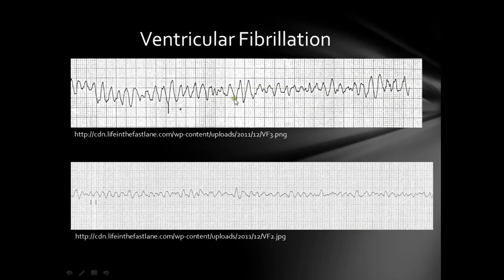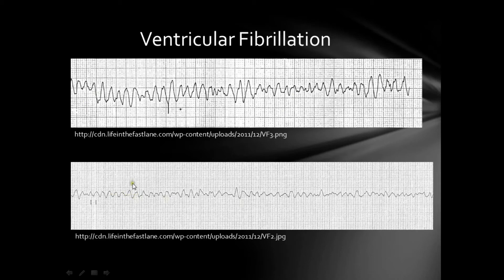On the first ECG here, we can see a typical coarse ventricular fibrillation: chaotic irregular deflections of varying amplitudes with no obvious P waves, QRS complexes, or T waves. With the second ECG taken from lead 2, you can see fine ventricular fibrillation — the same description as the coarse one, but simply with shorter amplitudes.